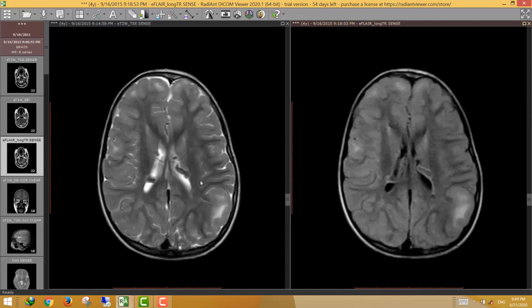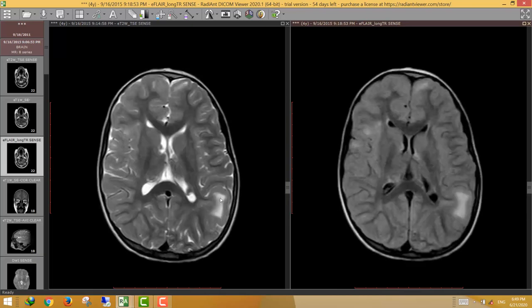So this case shows tuberous sclerosis with subcortical tubers and subependymal tumors, with characteristic features: the subependymal nodules differ in signal from gray matter, show perpendicular orientation to the ventricular outline, and the subcortical tubers characteristically stretch or expand the overlying cortex.